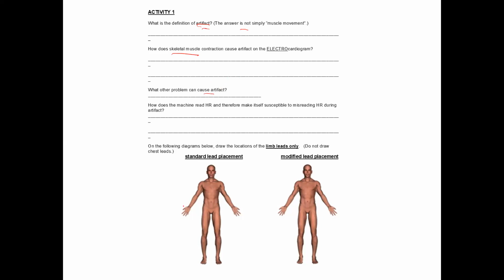There's other artifacts too. While we're on this picture and we're recording, this is the difference between standard lead placement and modified. We would be doing modified limb lead placement today. And that's the one which was described in the first page.